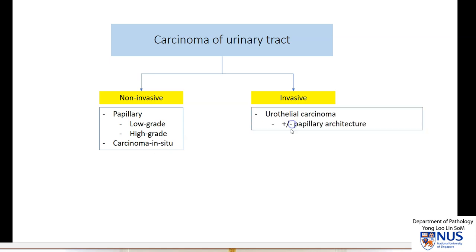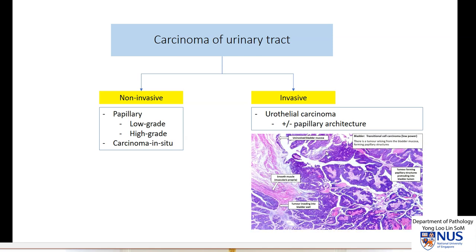Invasive urothelial carcinoma may also sometimes have a papillary architecture. Here is an example of a urothelial carcinoma which does have a papillary architecture — you can see these finger-like fronds covered by epithelium. But at the same time, this tumour happens to be invading into the wall as well. This is an example of a bladder carcinoma.